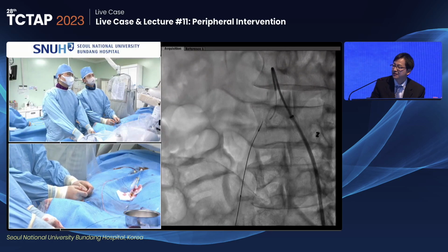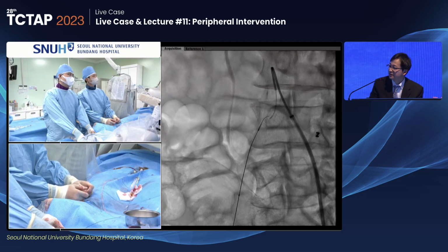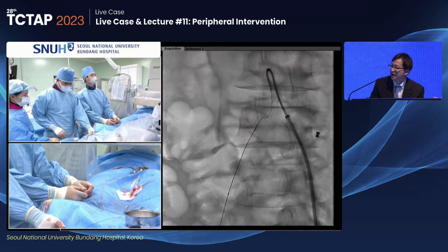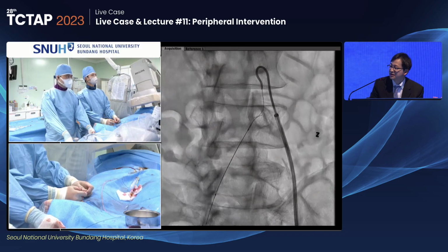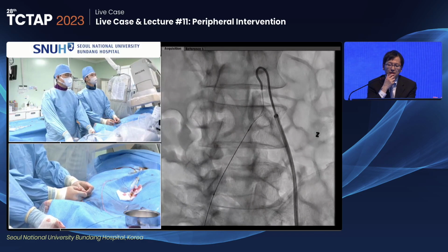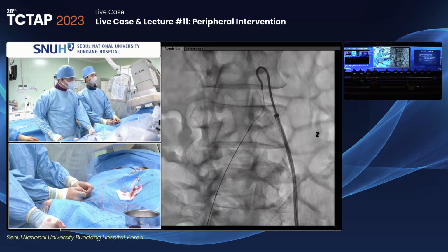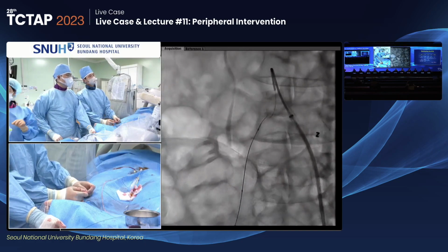I personally use the Astato to penetrate the cap. You like the Astato 30 gram, 18 thousandths wire? Or I love the 14 Astato. I've had great success with the 30 gram, 18 thousandths Astato wire for these cases. It gives you a little bit more directional push.